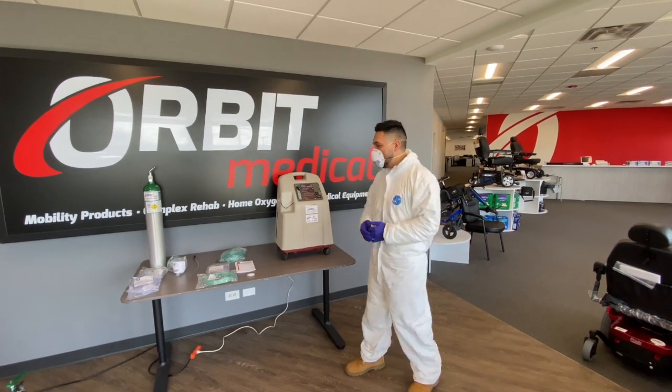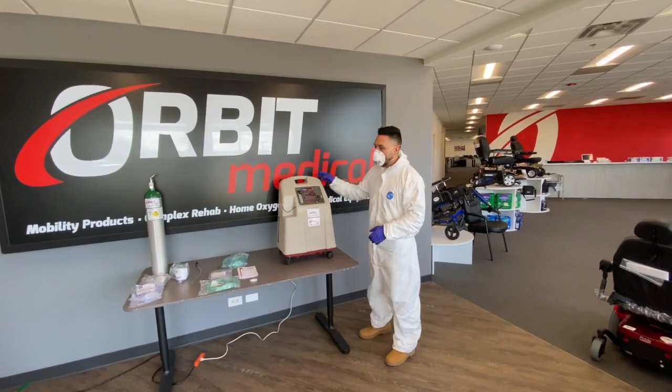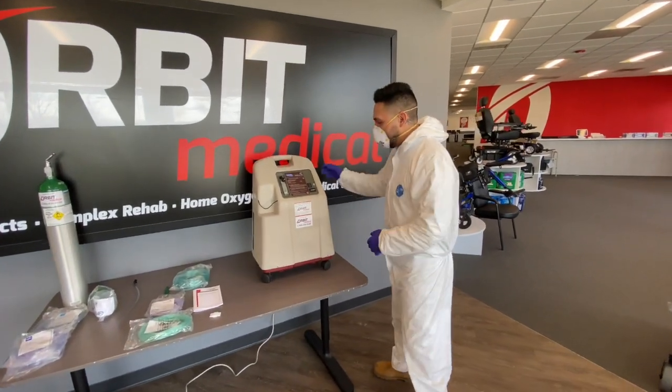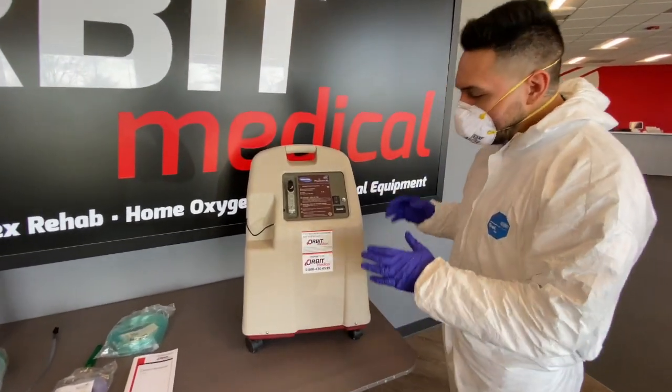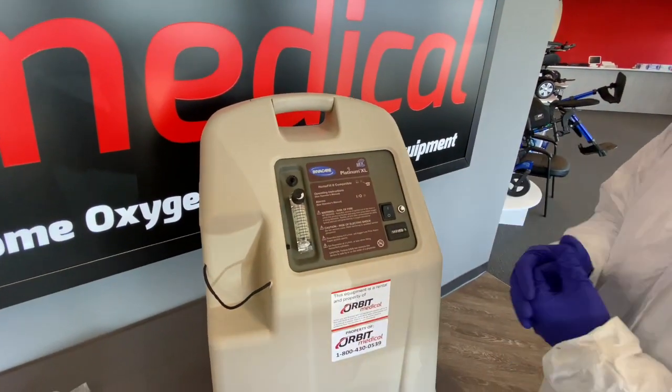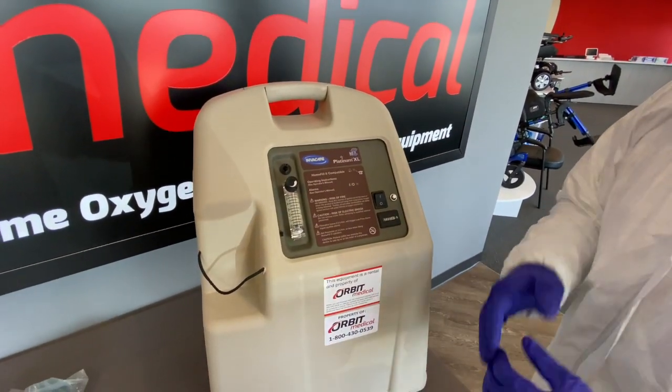All right guys, thank you for choosing Orbit. In this video I'll be demonstrating a five-liter concentrator setup. Right in front of me I have a concentrator, and what I want to start off with is first explaining what everything is, and then we'll go ahead and explain how to connect everything together and set it up.